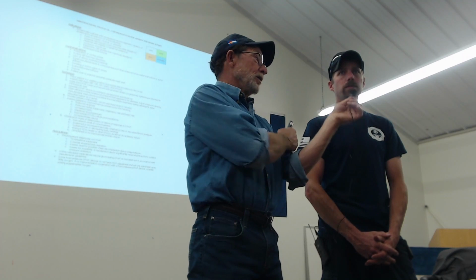So Melanie, for those that might listen to this later, is telling us of a patient that she and Tyler had who had throat cancer and lung cancer and was in respiratory distress, and CPAP helped that patient's symptoms. We don't know the etiology of that patient's respiratory distress, whether it was upper airway obstructive or lower. I think it was upper, if I recall right. He didn't make it through the day. Well, you do no harm to those patients for sure.